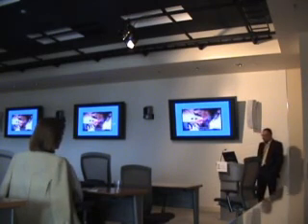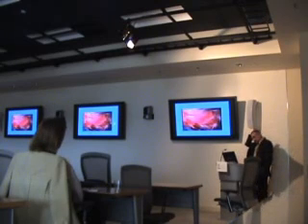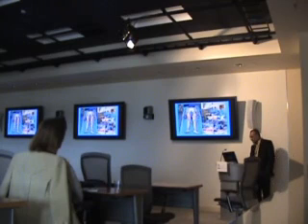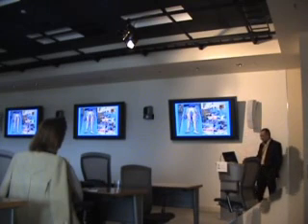Another application for this model, we can practice skull fractures. Here is simulating a skull fracture with injury to the sagittal sinus, and you can see the bleeding from the sagittal sinus. So we can practice how to deal with such a problem. Now, the model can be applicable for other surgical disciplines.